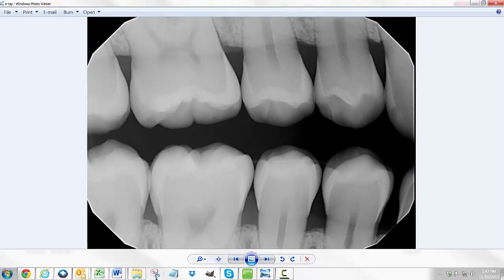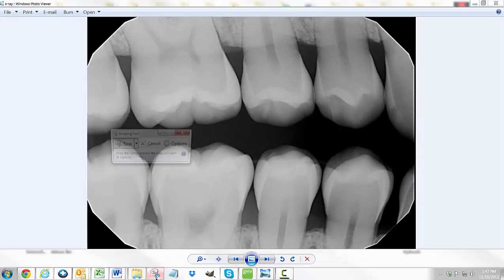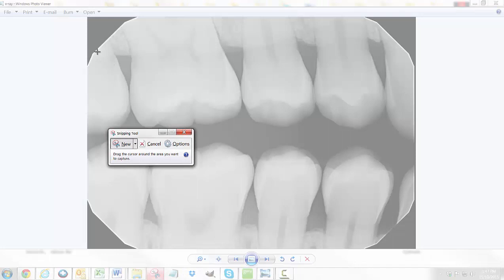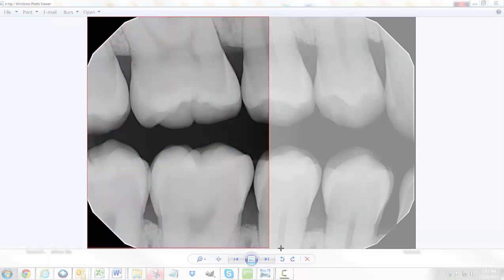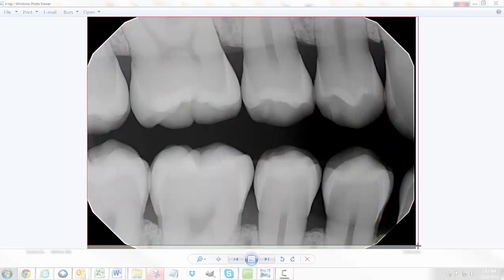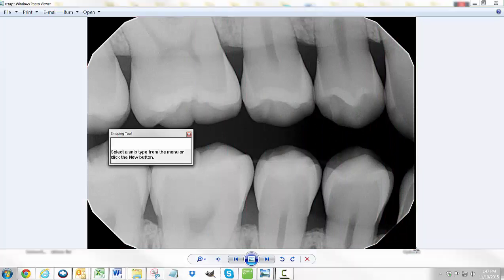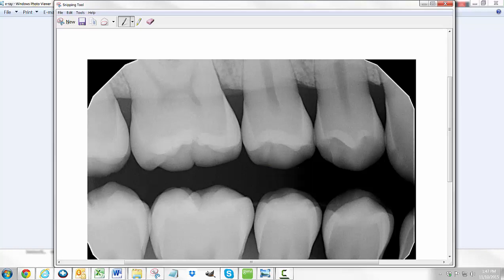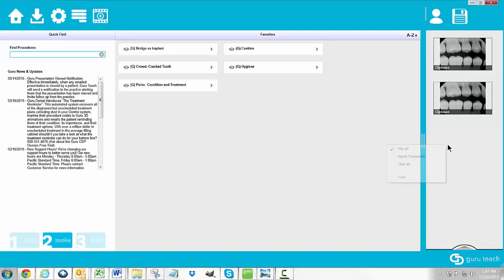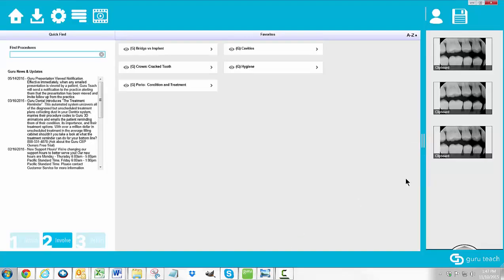It's a really great tool and works great with Guru. The way the snipping tool works is when you open it, the screen is going to go hazy. You can then create a box around whatever you want — in this case, around the x-ray image. Once you do that, it will open the image you just captured in a new window. To get it into Guru, all you have to do is right-click, copy it, right-click, and paste.